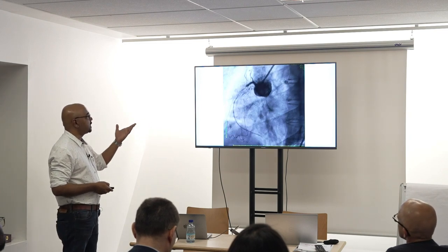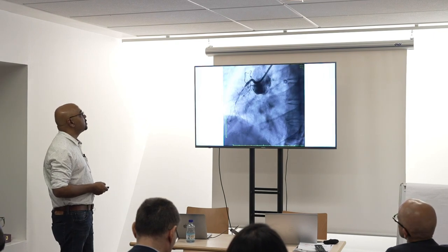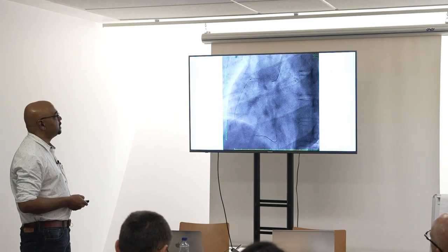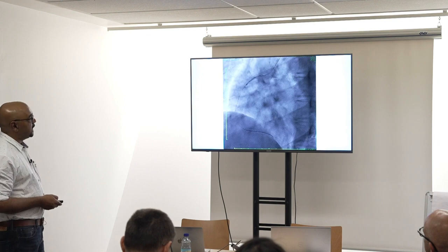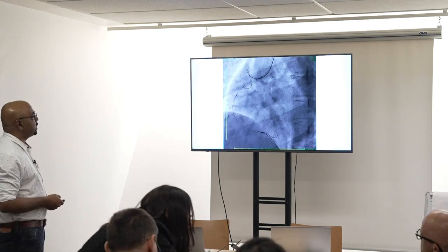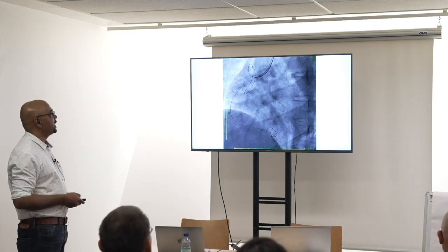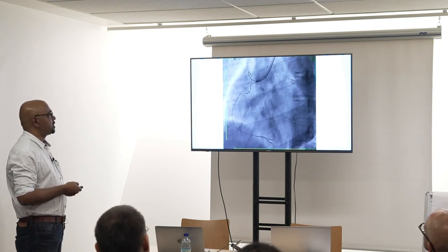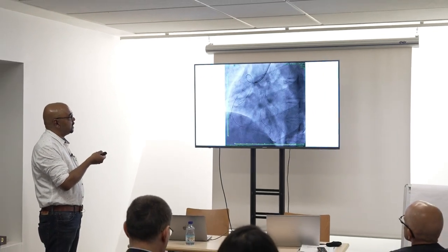This is an RCA critical lesion with a clear lumen. So I thought it's not going to be difficult. So I crossed the wire. This is a normal balloon, wouldn't cross. With a lot of attempts, I tried to dilate it and serially go down, but of no use. Then I had to put a buddy wire, then an anchor wire, and finally this was the 0.75 Alveo HP, which crossed with a lot of effort. You can see how long, you can see the guide backing out.